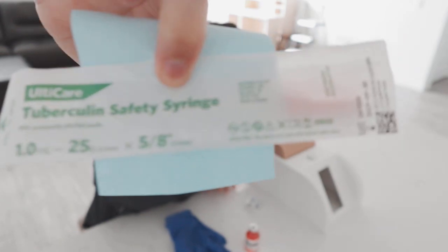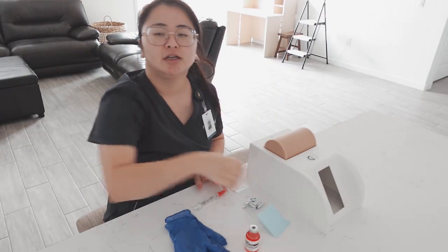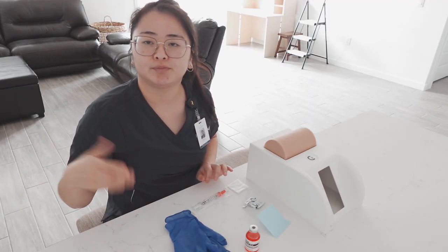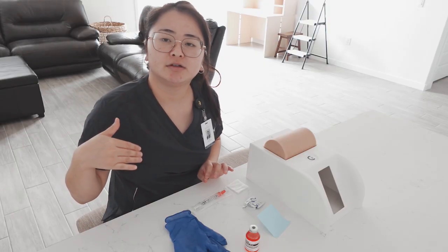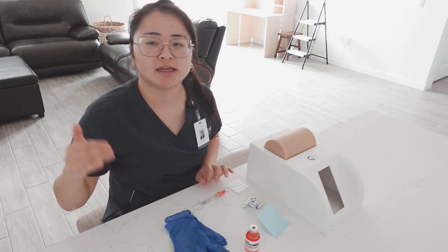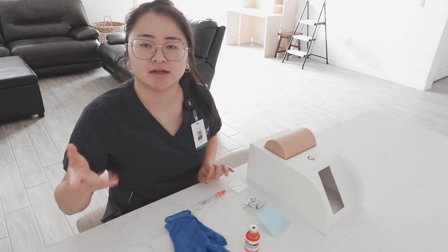So here is my tuberculin syringe. For this particular injection, the syringe we need has to be 1 milliliter. And for the needle, it has to be a 25 to 27 gauge, 3/8 to 5/8 of an inch.